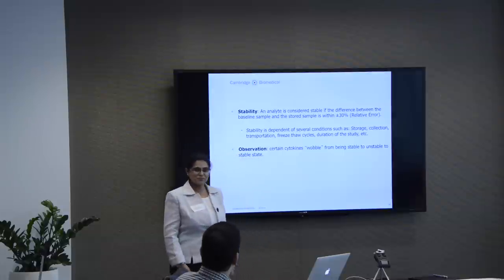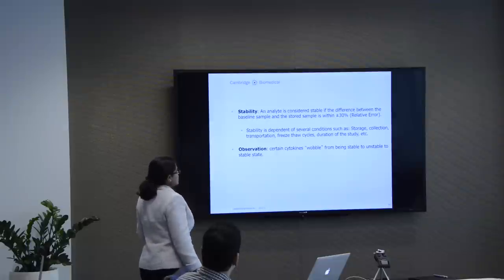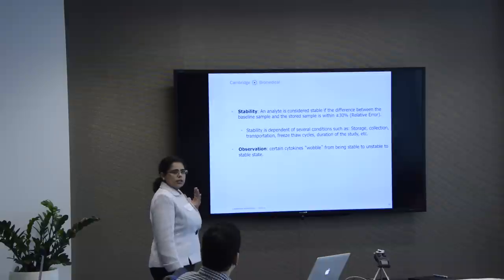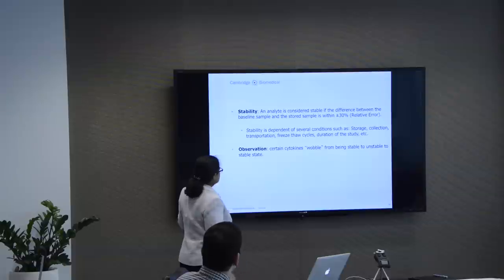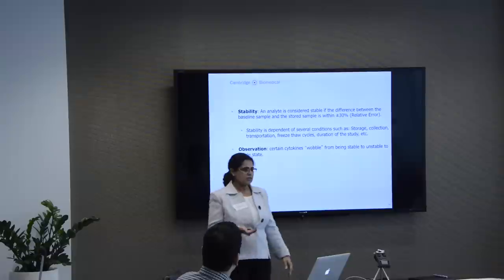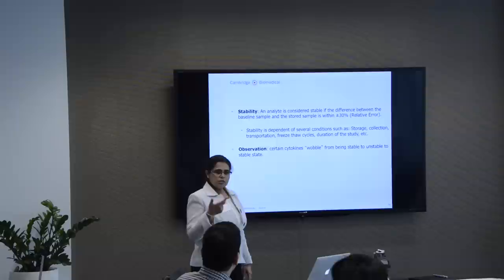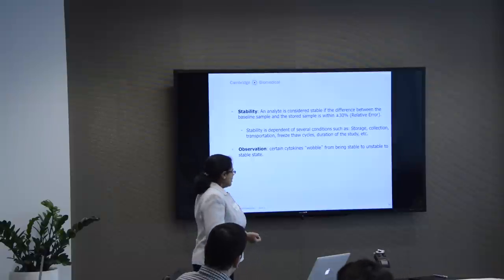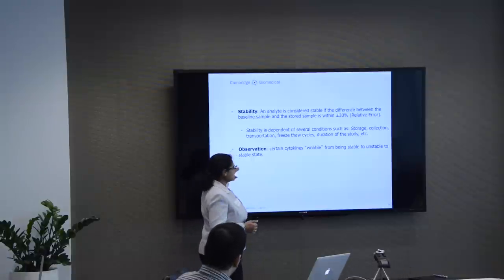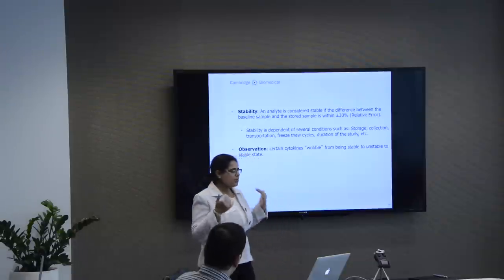Stability. So an analyte is considered stable if the difference between the baseline sample and the stored sample is within plus and minus 30%, or that relative error. And stability is dependent on several conditions: the storage, the collection, the transportation, the freeze-thaw cycles that it goes through during testing, the duration of the study, how long the sample has been stored. And this is what we observe, that there are certain cytokines that wobble from being stable to unstable and back to that stable state.